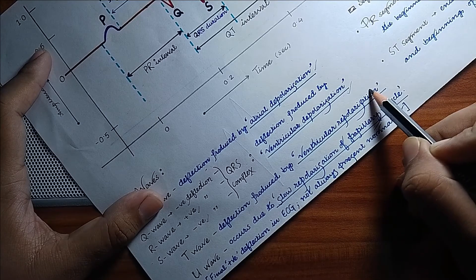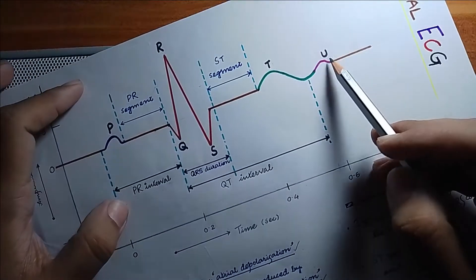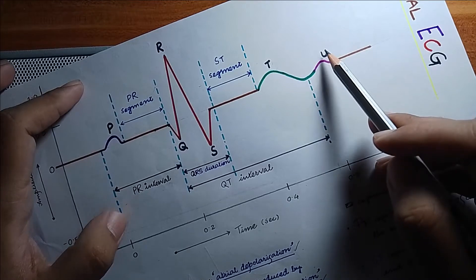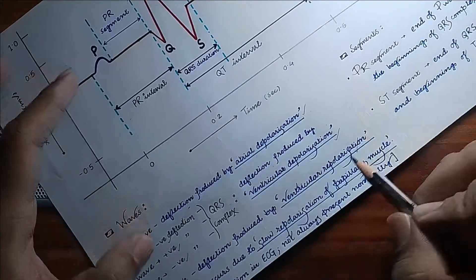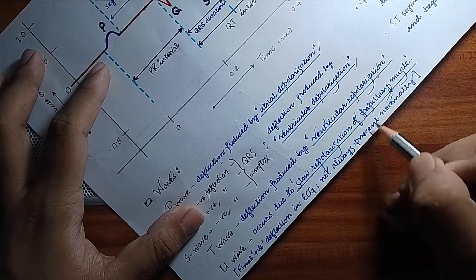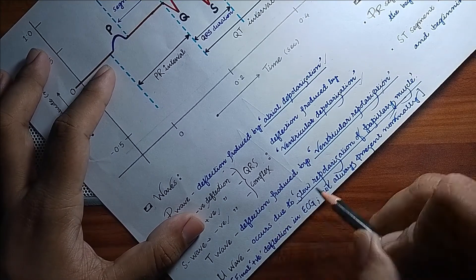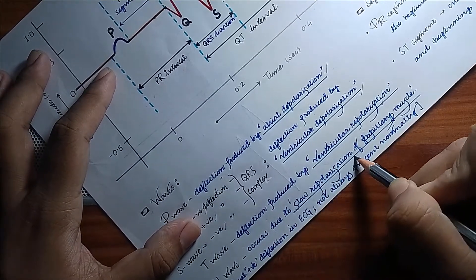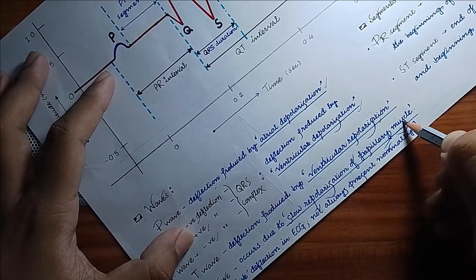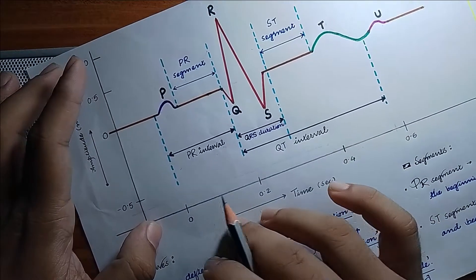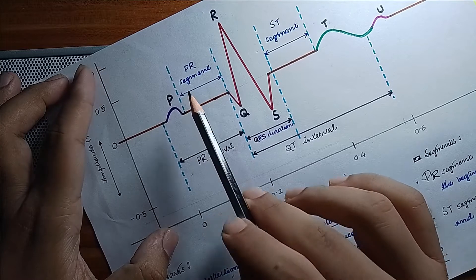Now you can also see a U wave. It is not seen commonly in ECGs, but it occurs due to slow repolarization of papillary muscles. Now we will see the segments. There are two segments: PR segment and ST segment.